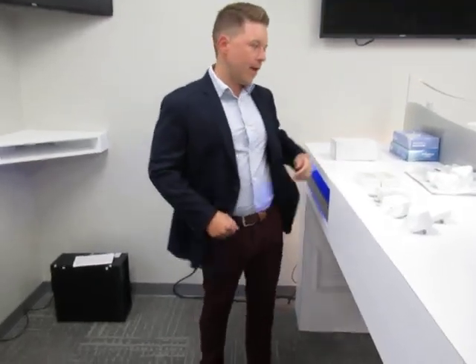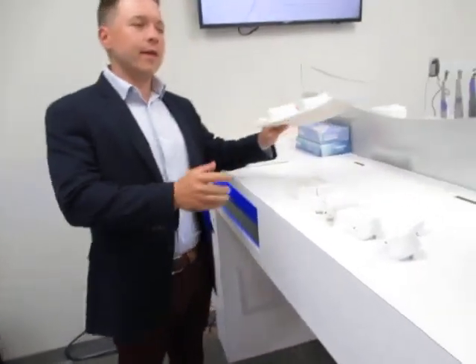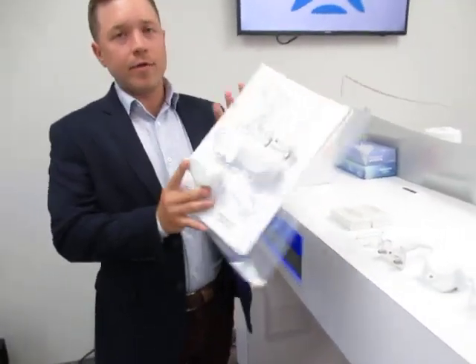Good afternoon. I am John Kratz, imaging specialist with ACTION North America. Today, we are going to talk about the accessory kit that comes with the Prime 2D and 3D.